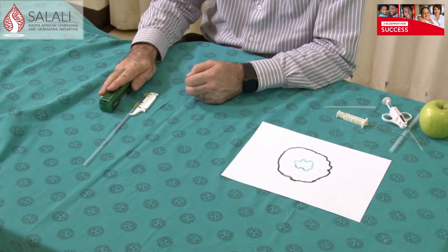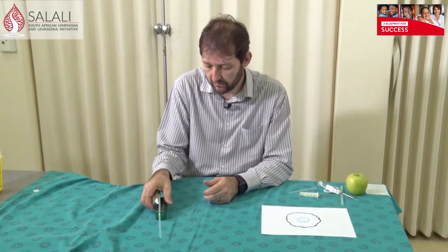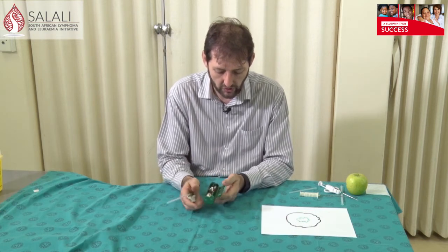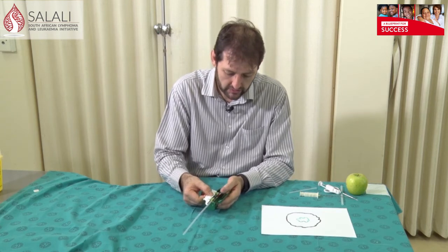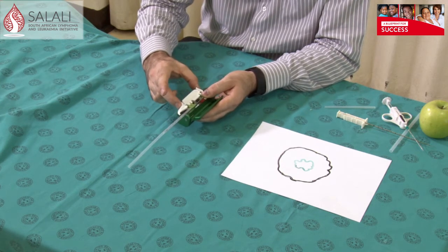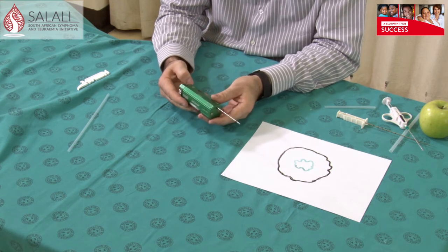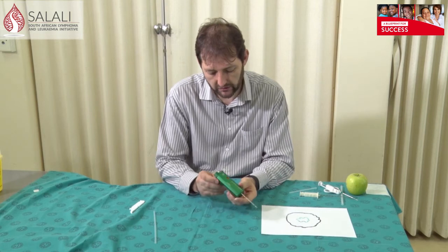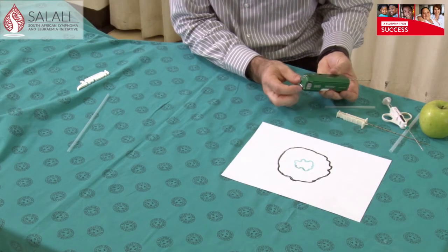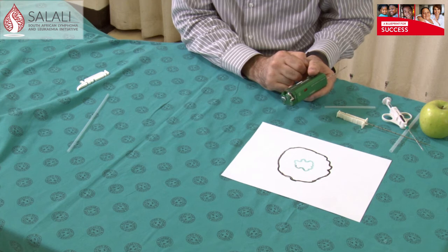In our clinic we use the reusable hand piece with single-use needles that fit into the hand piece. These needles are easy to engage. One needs to open the hand piece — the needle is loaded by sliding it into the two notches, then remove the loading piece and close it, and your system is then ready to use. These hand pieces all have a safety mechanism so you cannot fire unless the safety is off. At the back you need to take the safety off.